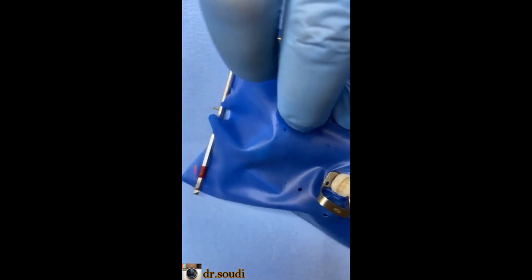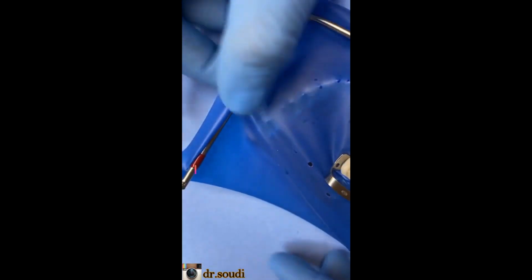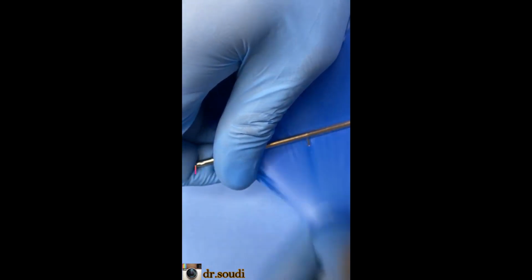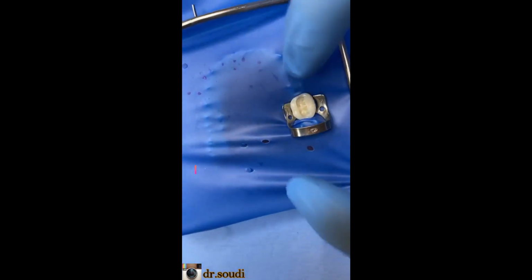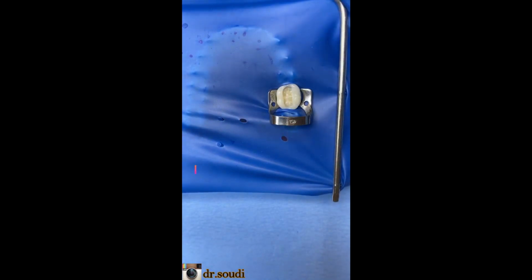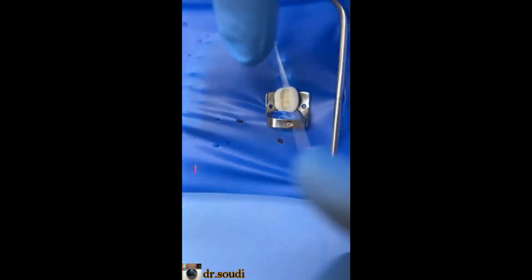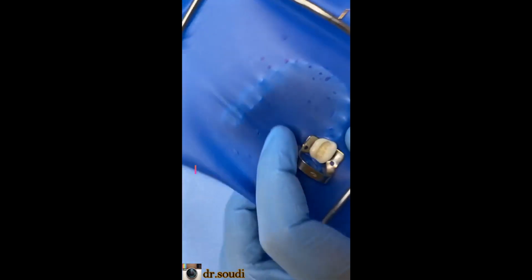After this, you should stretch your sheet for all projections like this. Stretch your sheet. You don't need the sheet to be folded like this. After you place your clamp, again with floss, pass it anterior to the tooth to make sure we don't need surprises. Okay, so you should place your dental floss between the two teeth to make this sheet pass between, and also from the posterior to the molar you are working on.